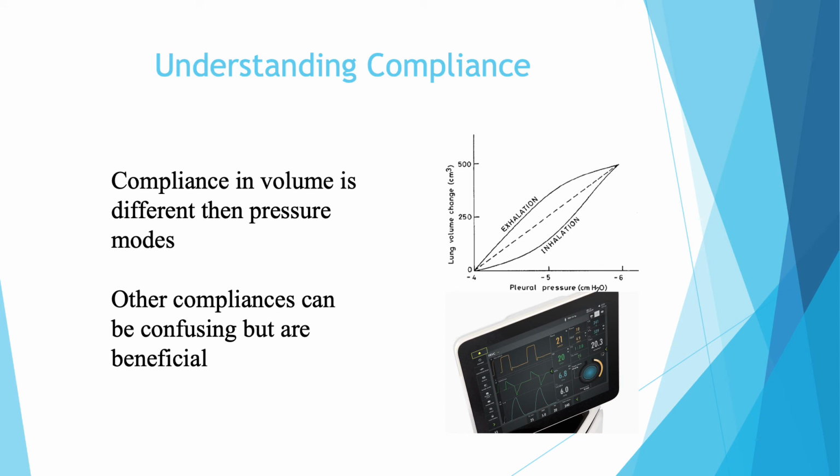In a prior slide, I talked about understanding compliance based upon modes. This is just a touch up with that, but one of the main ways you're going to understand it is through peak inspiratory pressure. And peak inspiratory pressure is going to matter when you're in a volume mode. In pressure modes, you look at tidal volume. I can't stress that enough. I see a lot of people forget that concept whenever they're managing ventilators.